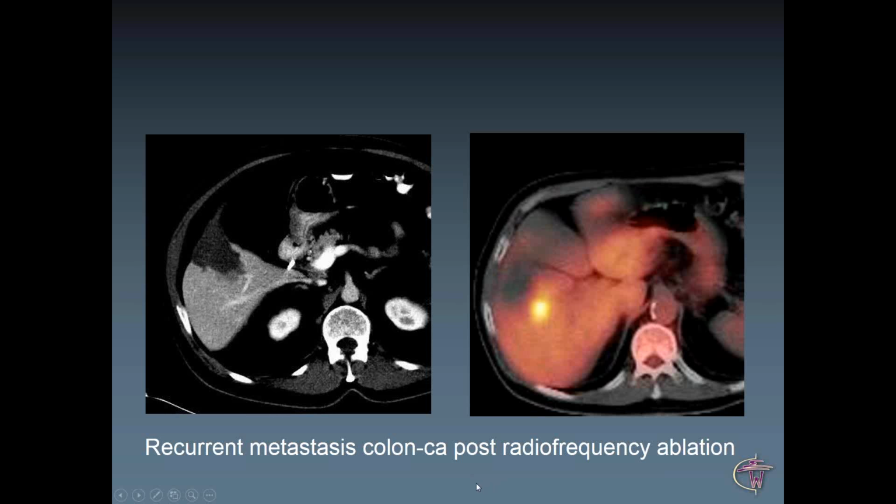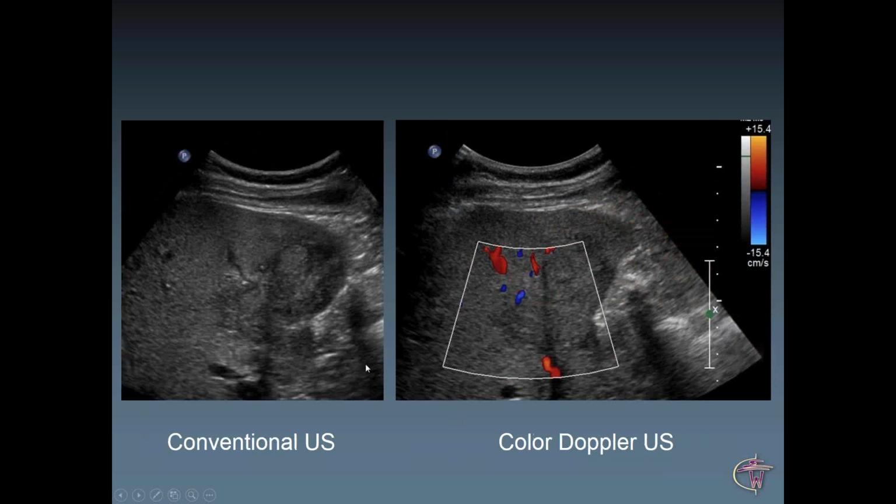That's a patient with an outside RFA recurrence who came to us. He has a recurrent tumor. There was a colorectal carcinoma next to the ablation zone right there. It was confirmed with FDG avidity. And then with ultrasound and a sagittal approach, you could see the ablation zone here, and we assumed that this one here is the recurrent tumor, but we couldn't really prove it.